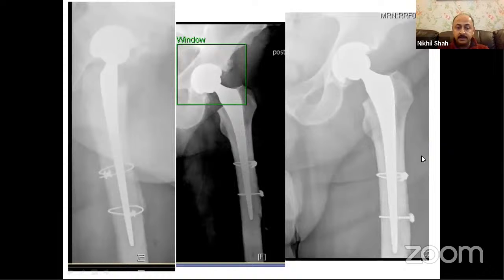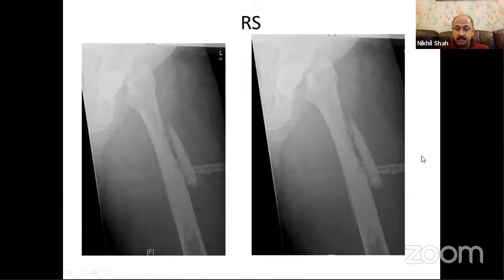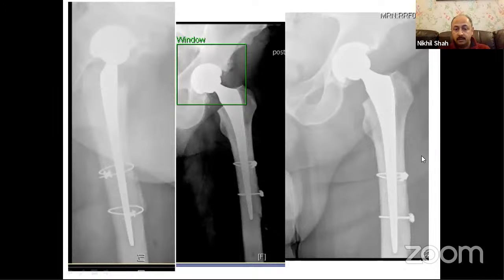So one of my colleagues did it. And again, we discussed all the options. You can see that there is quite a long 6 to 7 centimeters of cement column in the distal fragment. So the options are to try and put a hip replacement in after taking that cement column out, or to just put a hip replacement in whatever femur is available to try and get a quicker and perhaps a less invasive operation. And that was what was done. So this is an intermediate length AMT stem, which is about 170 millimeters, and it was just appropriate for whatever femur was left. And I thought this was quite a nice reconstruction, and the patient also did quite well.